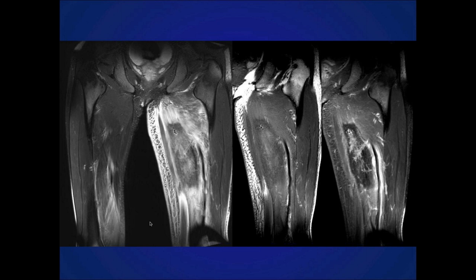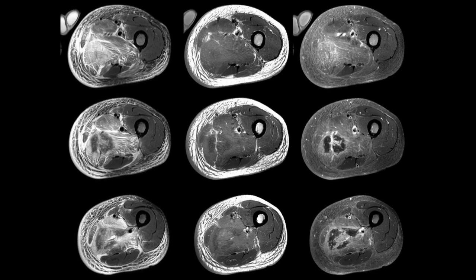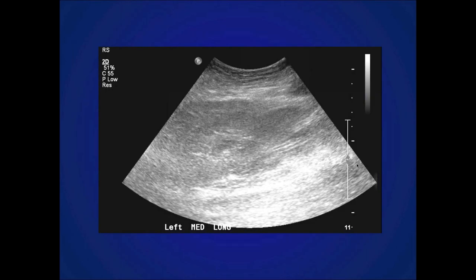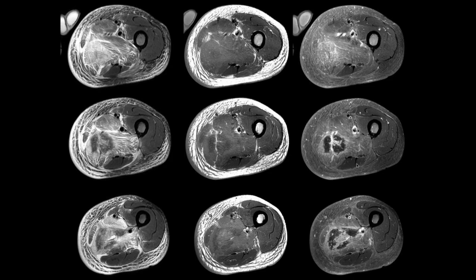We see marked edema involving the superficial soft tissues and the deep muscular tissues of the thigh on the post-contrast images. There's marked edema throughout the superficial soft tissues and the hamstrings. There appears to be a rim-enhancing collection within the center — I don't see a focal fluid collection on fluid-sensitive sequences, but that low signal area could be blood products or necrosis.